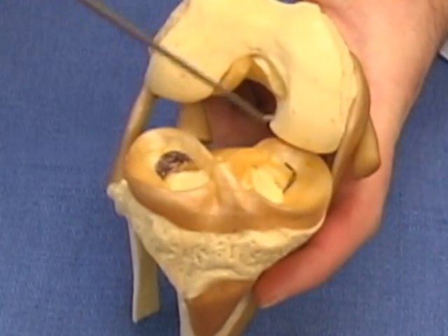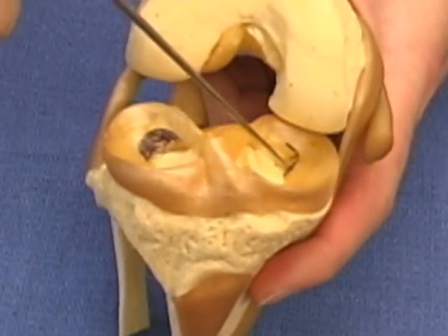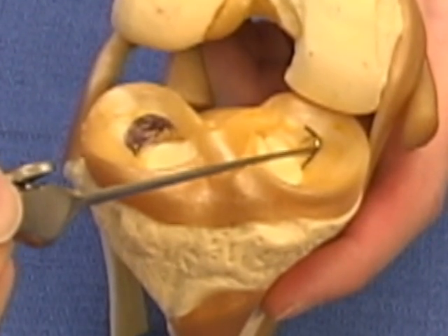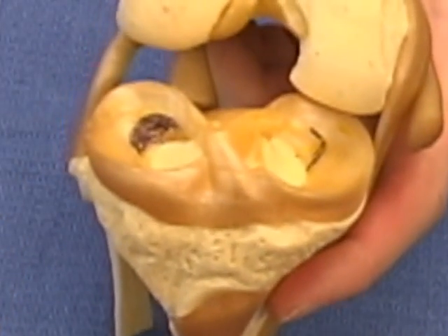This model demonstrates what a torn cartilage would look like. On the other side of the model, the shaded area demonstrates the removal of the torn meniscus. The meniscus is rounded off so no sharp edges are present. After surgery, an analgesic is injected into the knee. The patients are usually able to walk the day of surgery. They use crutches or brace for a day or two. However, crutches and brace are usually optional.